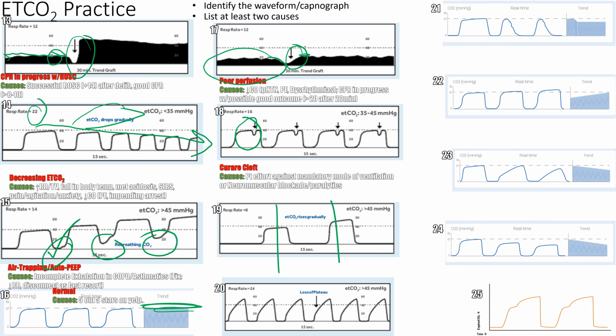That's different. That's 2 breaths compared to the other ones that have at least 4 or 5 breaths. So that CO2 is going up and it's more than 45. This is someone that's hypoventilating. What's another cause? What would cause hypoventilation? Over-sedation, good. They got too much sedation on board. There could be something neuro happening. Narcotics. Okay.